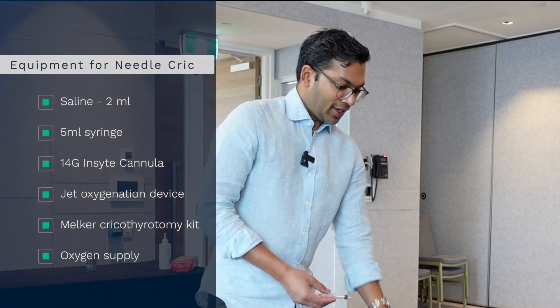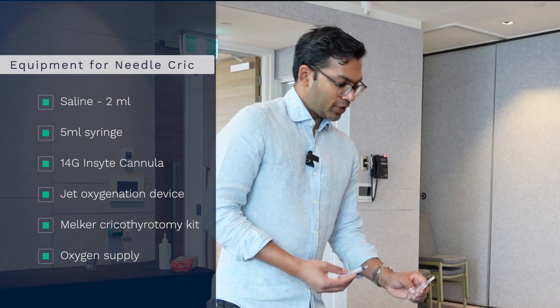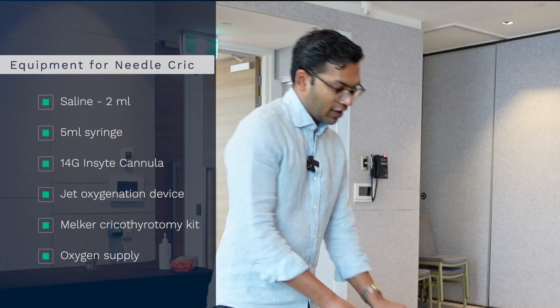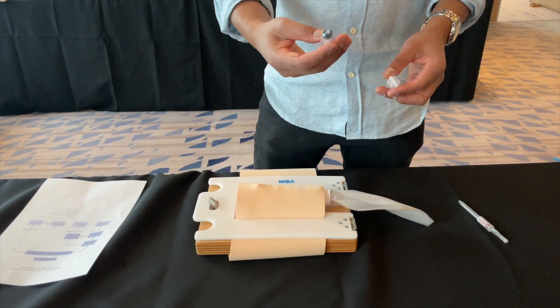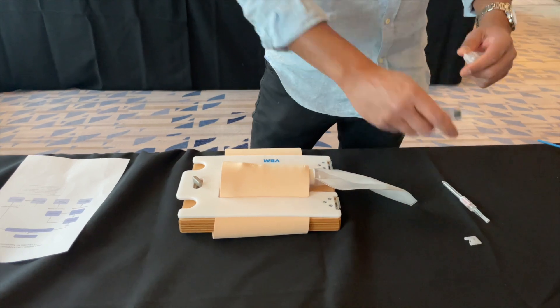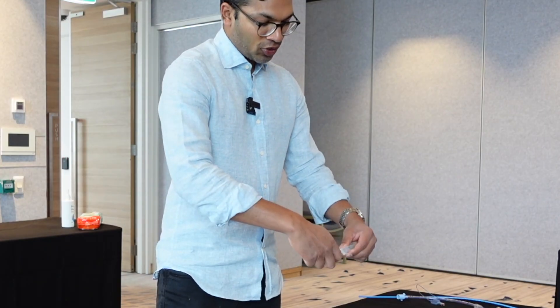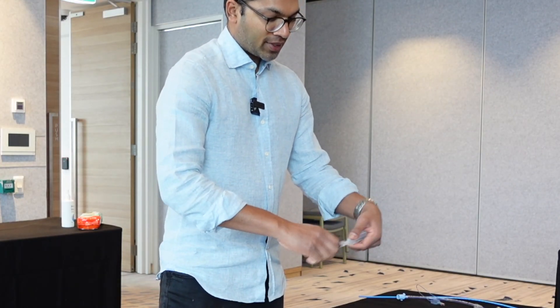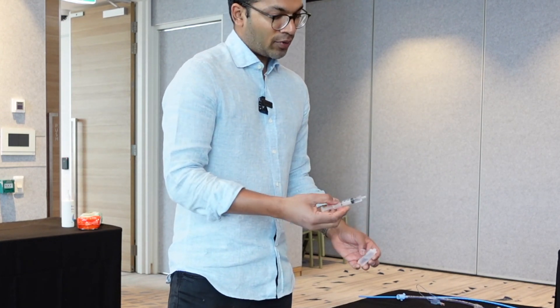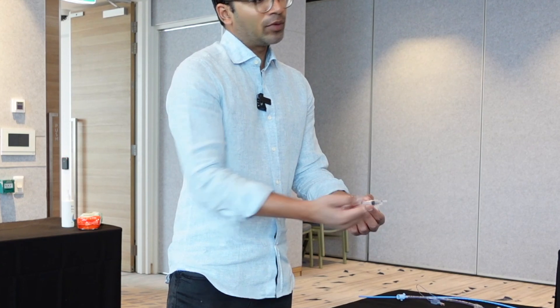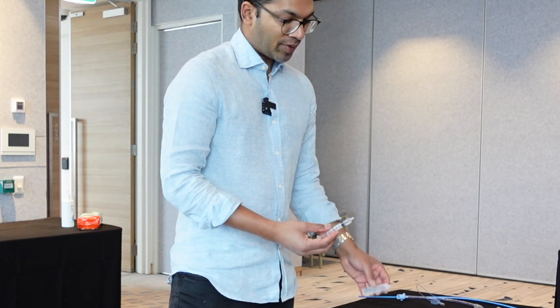The equipment I need is some saline, a 14-gauge Insight cannula, a 5ml syringe, and I've got to make sure I've got some kind of rapid oxygen or jet ventilation oxygen device — here we have the Leroy Rapid O2 device and some oxygen. First thing I do is take a 5ml syringe and put 2ml of saline, because you want to be able to aspirate air into the chamber to confirm you're in the right spot.